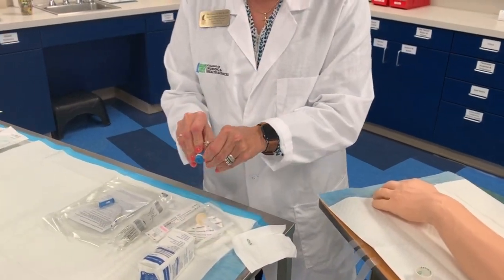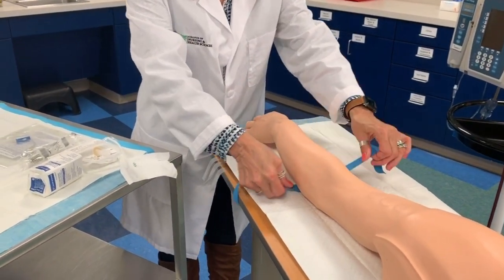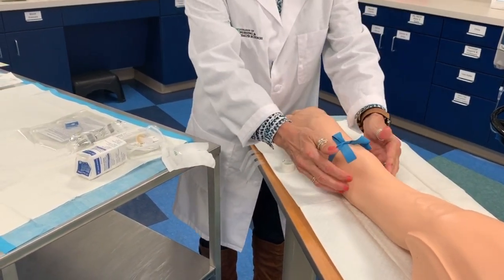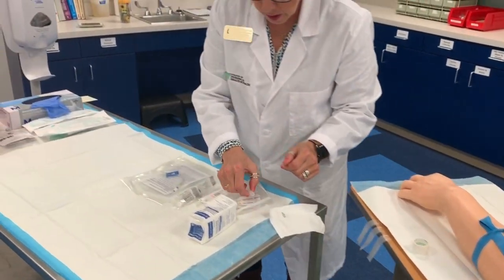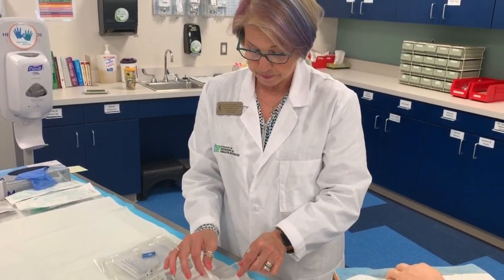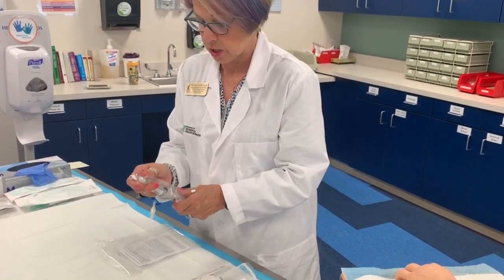You'll have your tourniquet, and I like to go ahead and put that on now while the veins are popping up while I'm getting my supplies ready. Be sure to put the tourniquet 4 to 6 inches above your proposed site, and a lot of times I put it up higher on the forearm so I have a look at what's going on. We also have our skin cleanser, and then our Tegaderm, and a 2x2 in our kit. We also need to get our extension tubing if we're using that, and we want to flush it with our saline syringe.